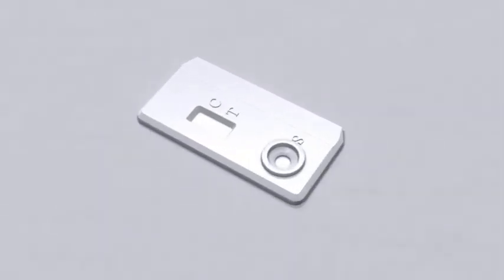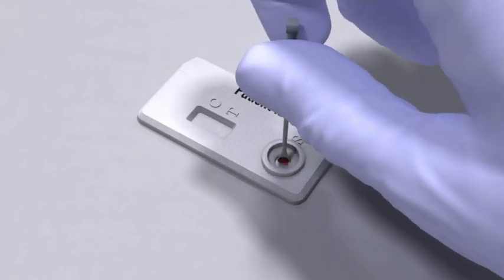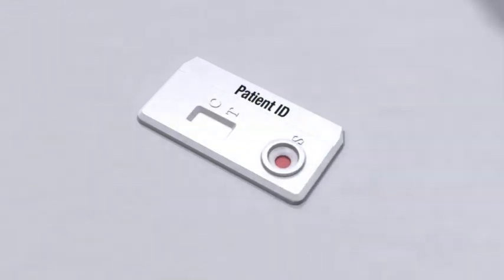Place the STATPAC device on a flat surface. Label the device with the patient name or identification. Touch the 5 microliter loop to the specimen, allowing the loop to fill. Hold the loop vertically. Touch it to the sample pad in the center of the sample well of the device to dispense the 5 microliters of sample to the sample pad.